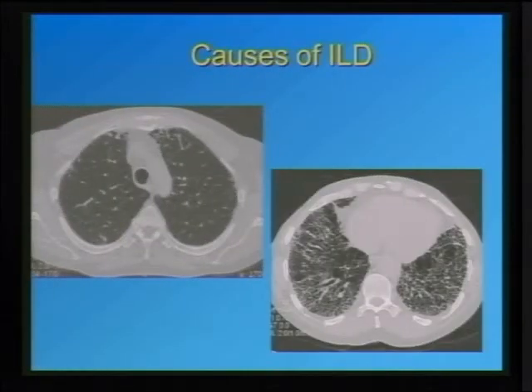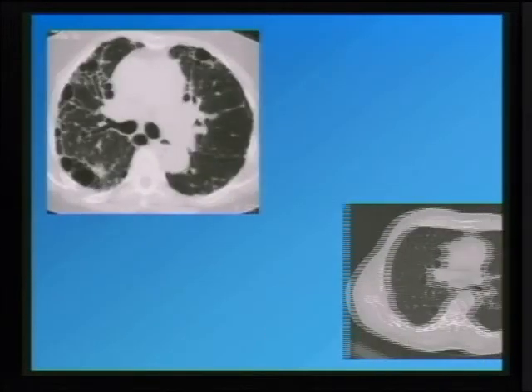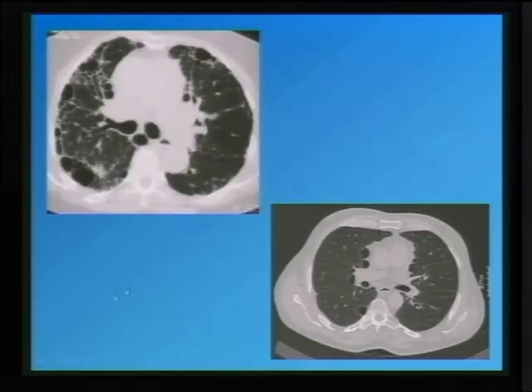And so, again, to contrast early interstitial lung disease due to pulmonary fibrosis, with the peripheral distribution as I mentioned, very early, and then the advanced disease, as you can see at the bottom, where you have honeycombing and cicatricial bronchiectasis. And do not mistake pulmonary fibrosis and honeycombing for a patient with paraseptal pulmonary emphysema.